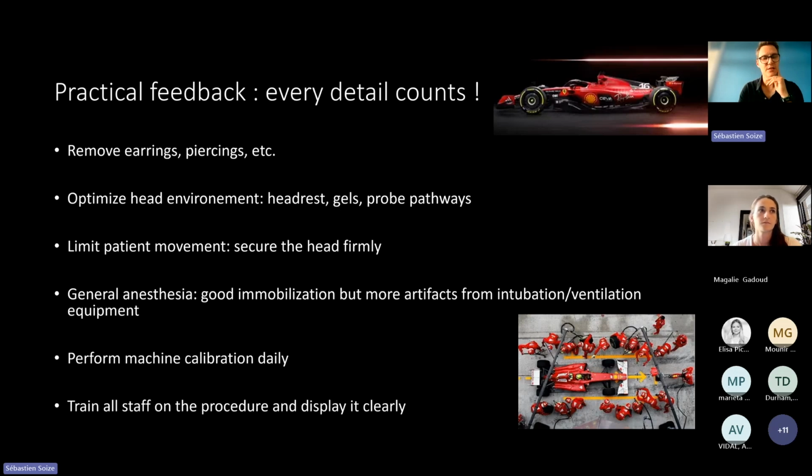In Philips, but it's also probably true in Siemens, but I will only speak for Philips, performing your machine calibration daily is super important, because the quality of your CBCT can decrease quite rapidly if you do it just once a week or once a month. And you can create some kind of target artifacts in the middle of your scan. And train your staff without the patient. It's really important that everyone has their own checklist and is aware that they are really prepared.